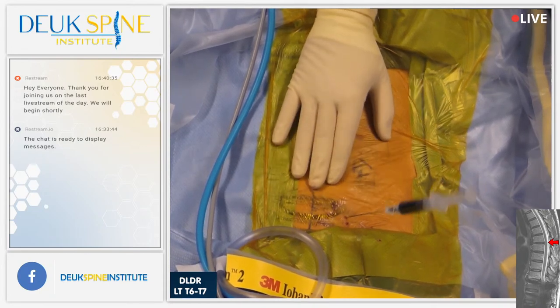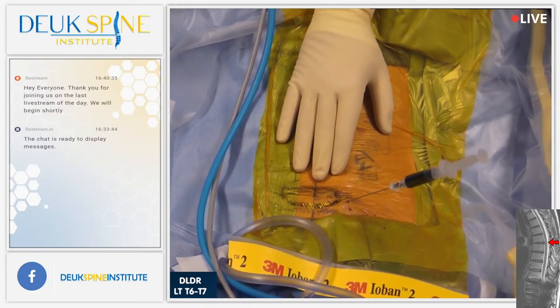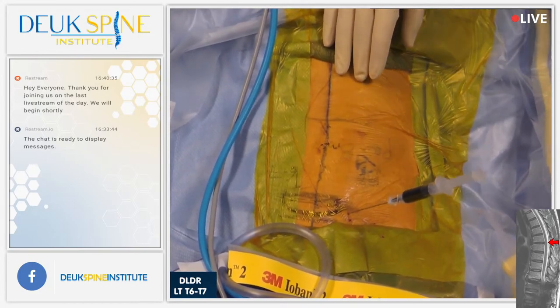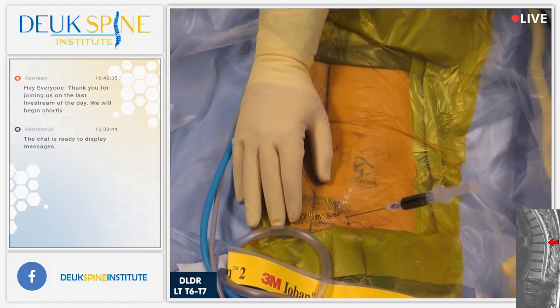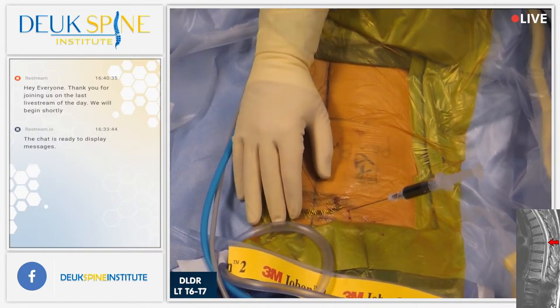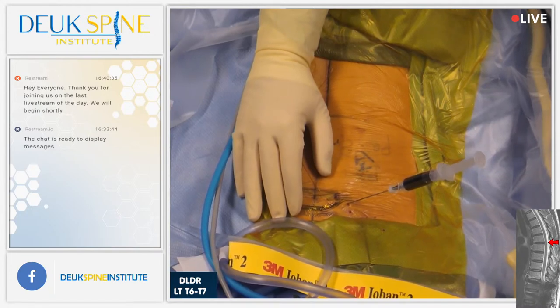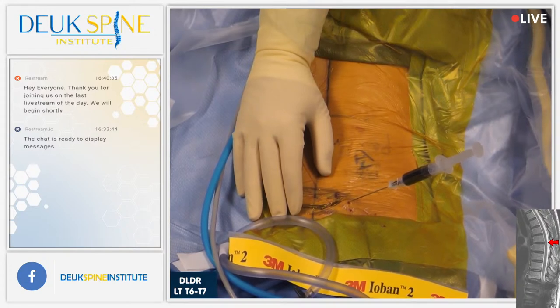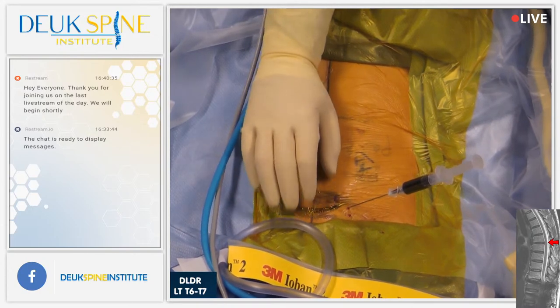Hey, are you awake? Yes. All right, good. Are you having any pain? Are you having any pain in your upper back? Hello, can you open your eyes? Any pain? No. All right, lay still, okay?